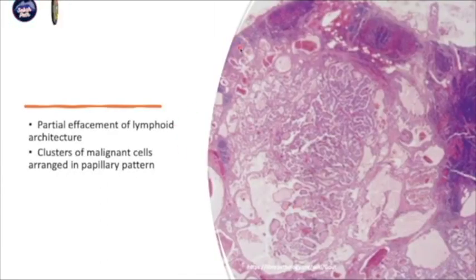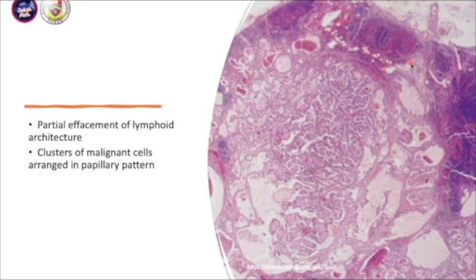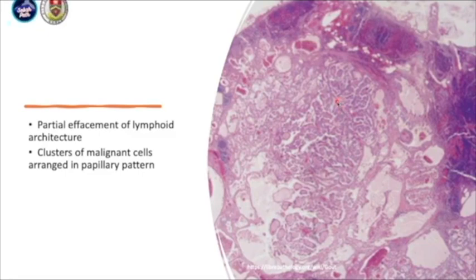When we process it through histological slides, the histopathological examination reveals a partial effacement of lymphoid architecture. Even though the gross appearance is almost replacing all of the lymphoid tissue, microscopically they will have a bit of normal residual lymphoid tissue, as you can see in this region. And you can see there's a cluster of malignant cells arranged in papillary pattern.